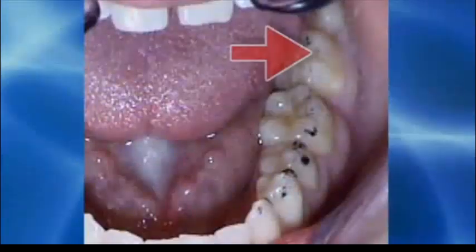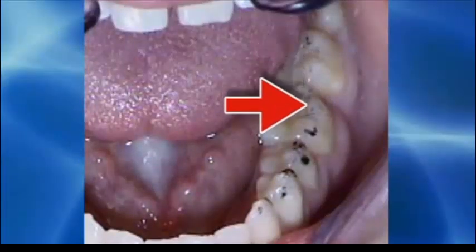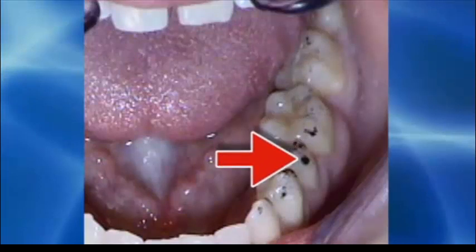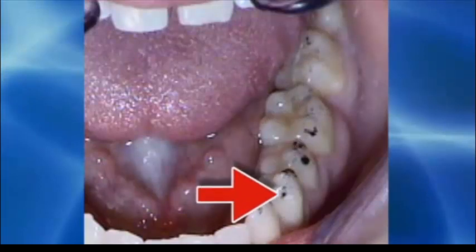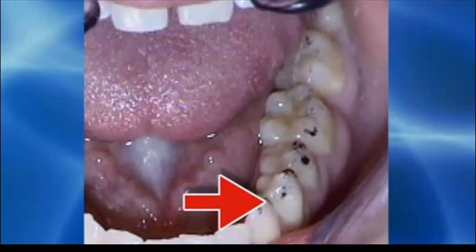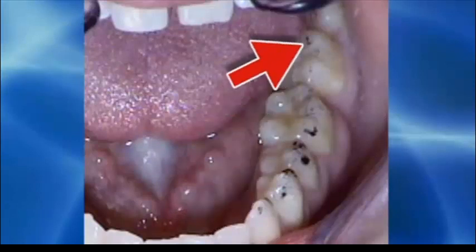On the lower teeth that contact those same upper teeth, you see cheek side group function on all the molars and the two bicuspids, and you see the guidance could be on the canine if there was less posterior tooth contact in the way, and there's also the balancing incline on the distal buccal aspect of the second molar.